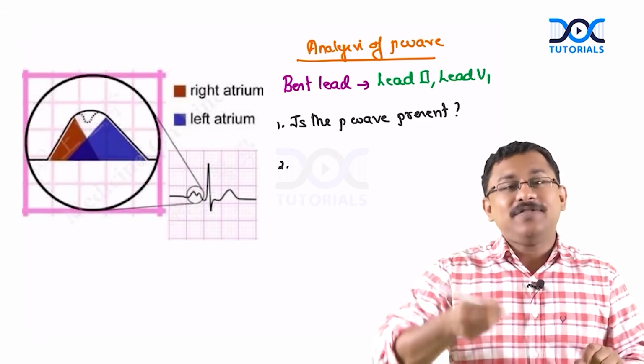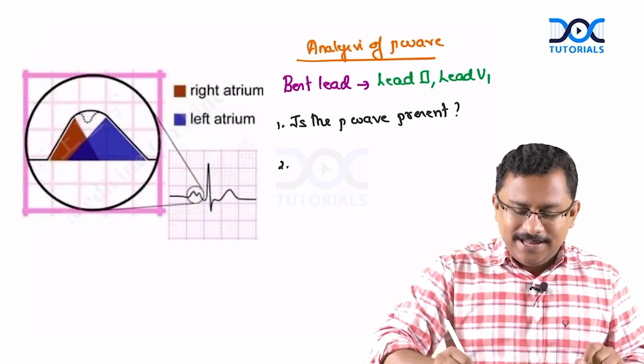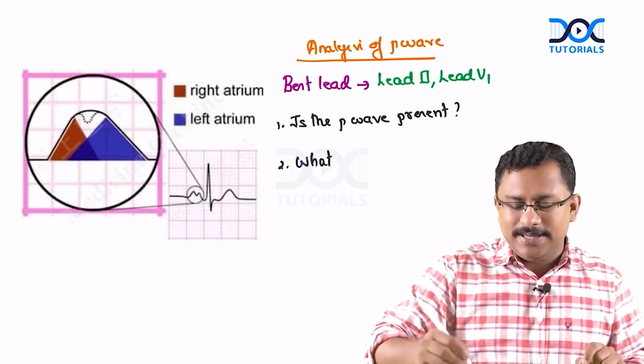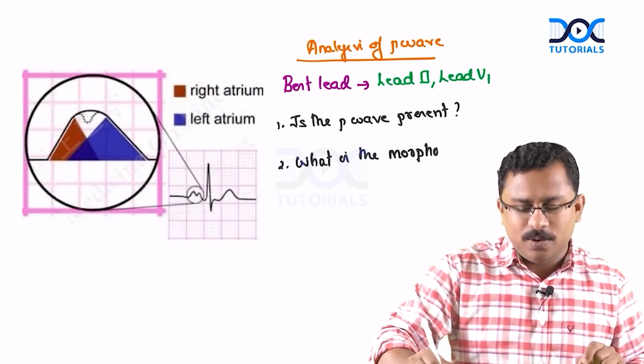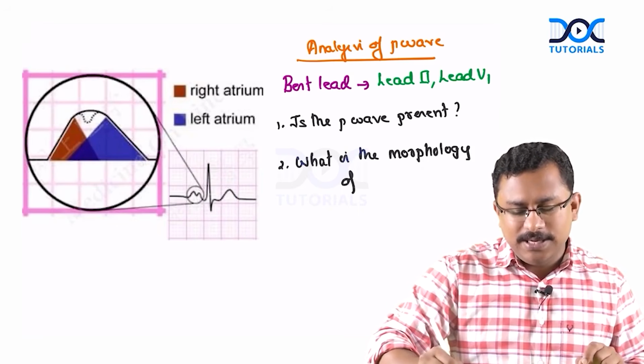Second, if the P wave is present, then the next question you have got to answer is, what is the morphology of the P wave?